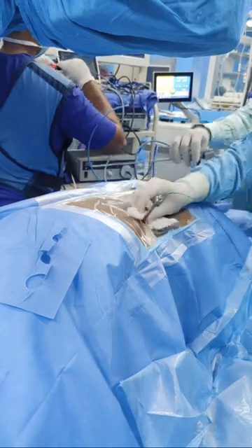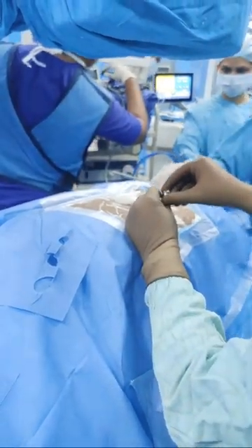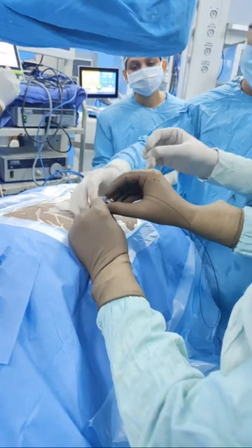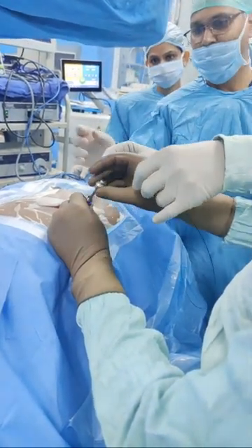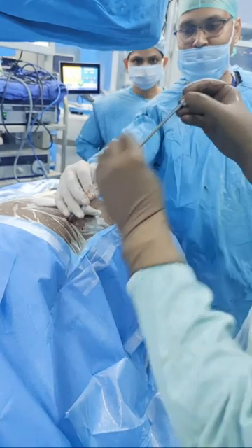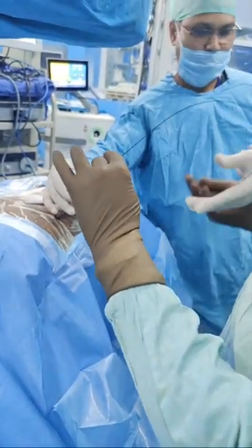Is it through the safety guide wire? Safety guide wire. Guide wire, of course. You examine by the side of the stone. You take out the guide wire. You leave the guide wire. Okay. Take out the guide wire. Yeah. Take out the guide wire. Okay. Keep pushing from below. Keep pushing a little saline. The guide wire was not coming.